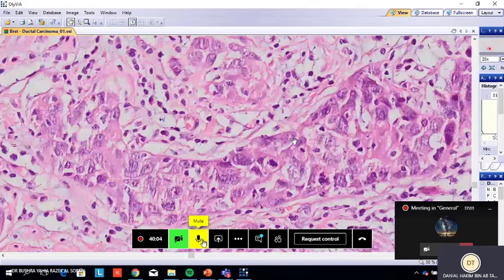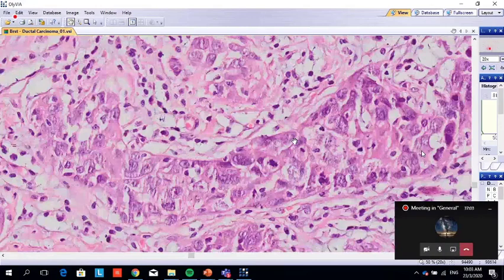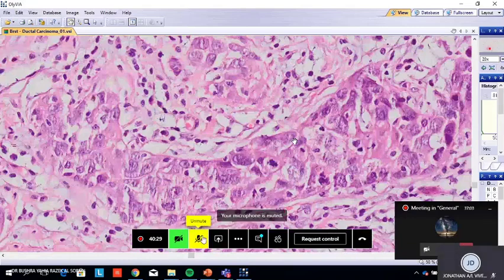Doctor, we can't hear you. Irregular and hyperchromatic nuclei. Doctor, we can't hear you clearly.